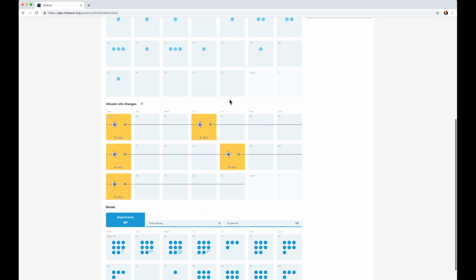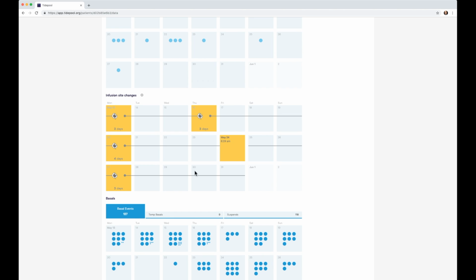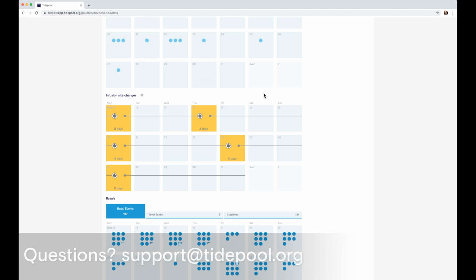Moving down the page, we have our infusion site section. Rather than your patient simply telling you they change their infusion site every 3 days, here you can see the data doesn't lie, as James Jellyfish had a few infusion sites that ran longer than 3 days. Here's one 4-day stint and another 4-day stint here as well. If you use this section to identify your patients running their infusion sites for 4, 5, or even 6 days, again, you have data to inform a conversation with your patients about how they're currently managing their diabetes.